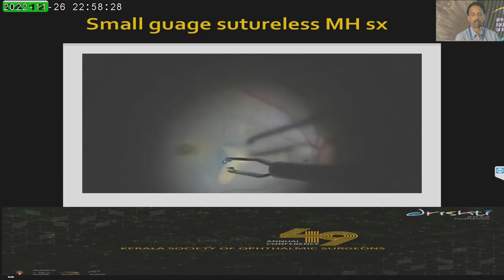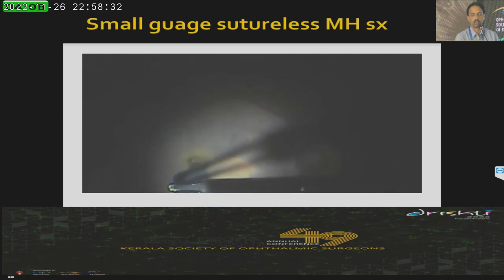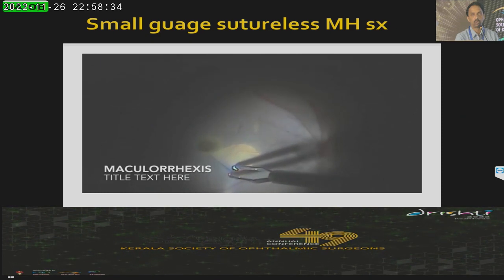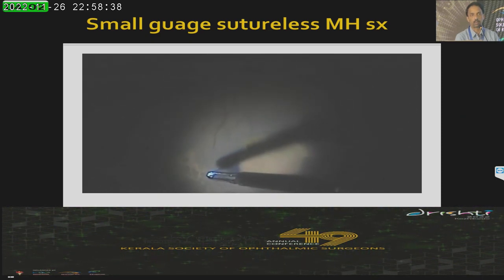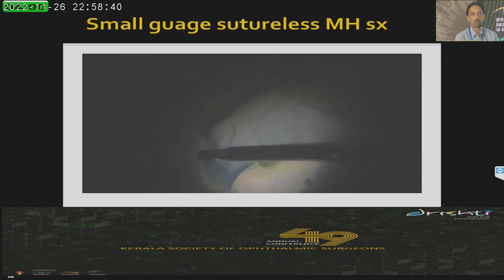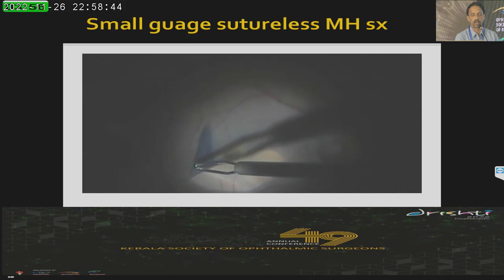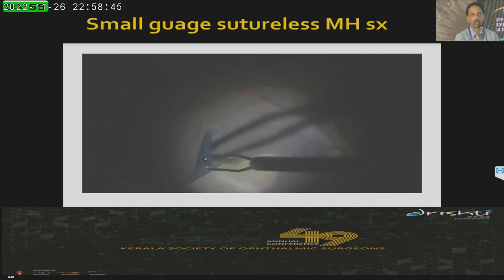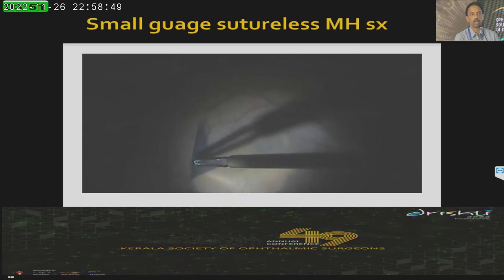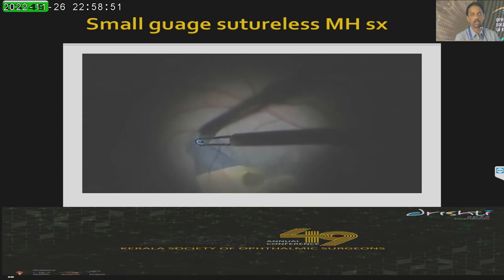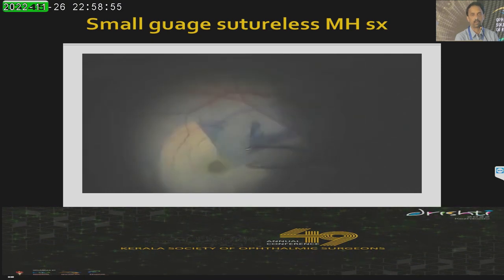There are techniques where some people like to go across the hole, and with techniques like the inverted flap where you want to preserve the ILM around the hole, you may need to go around the hole. It is always better to keep these flaps long so that you can control the area of peeling. There is some controversy on the area of peeling — whether you should peel large or small. The conventional peeling is around two disc diameters, while extended ILM peeling extends up to four disc diameters.